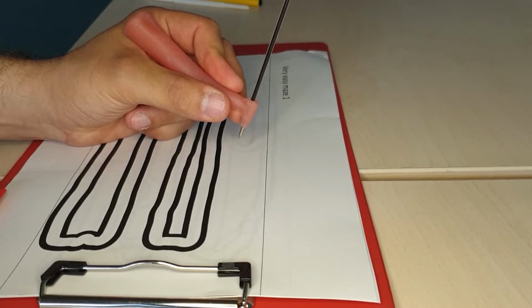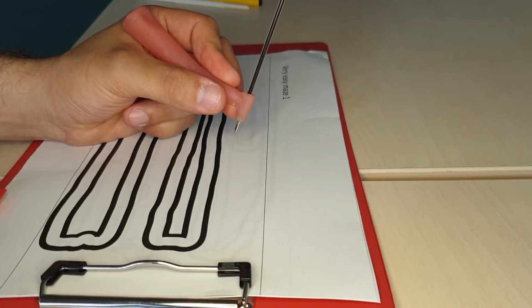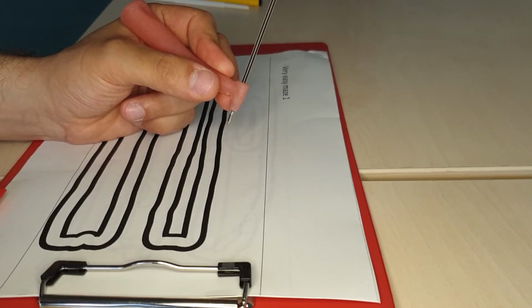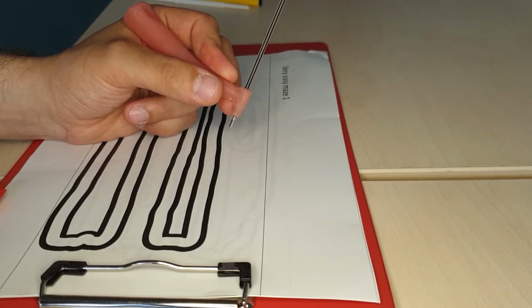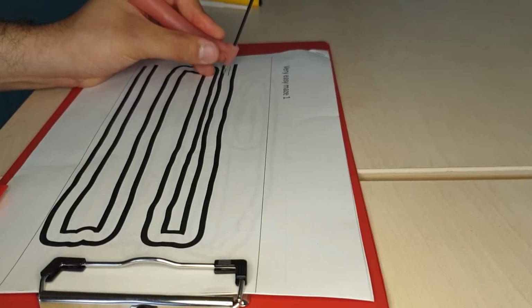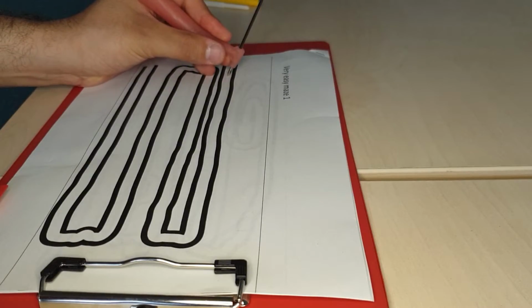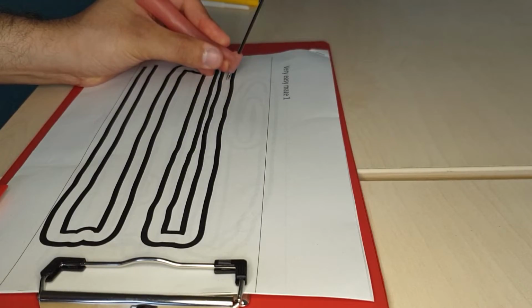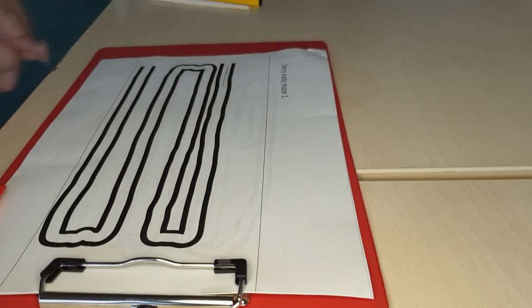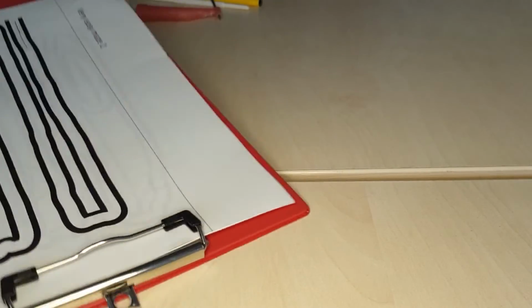This does fit in our hand the same way that a handpiece does. Slight differences would include the weight and the fact that there is no cable coming out the back of it. But for the first exercises, it works quite effectively, as you naturally find that you need a finger rest in order to control it. It feels a bit unusual, but after a few minutes of using it, it becomes quite easy. We use these in conjunction with different mazes.